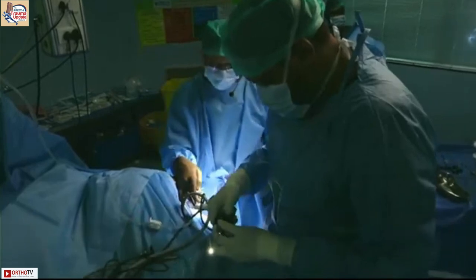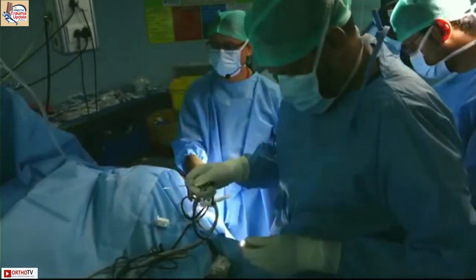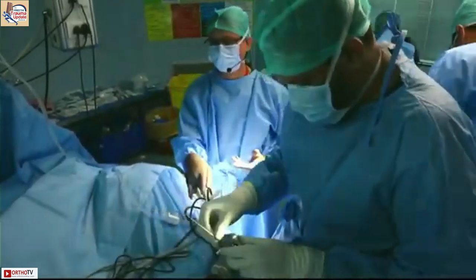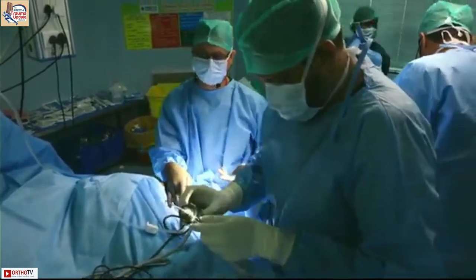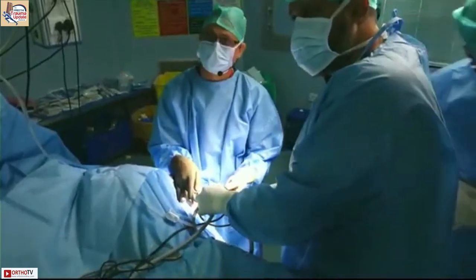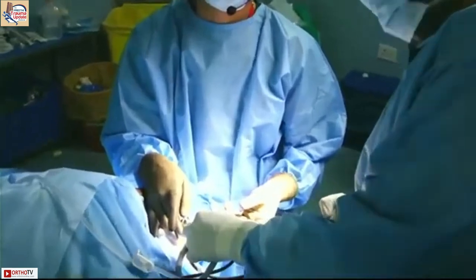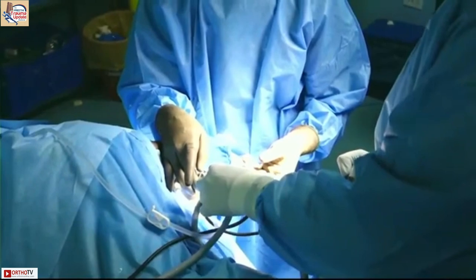I generally do scopes with 2.7, or maybe a 2.9, scopes probably supplied by ConMed. The reason is that it has a wider angle, so you can see a lot of things. So white balance. Just white balance. Okay. It's white, right? Thank you.